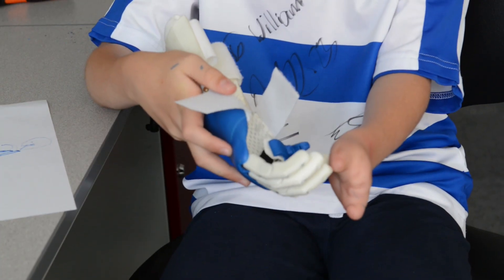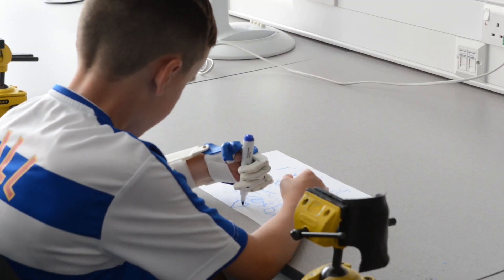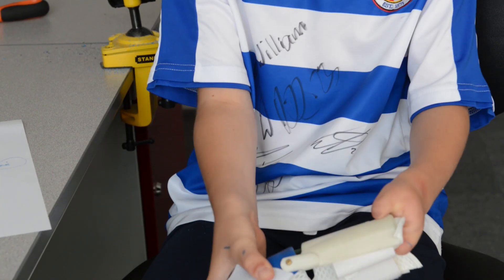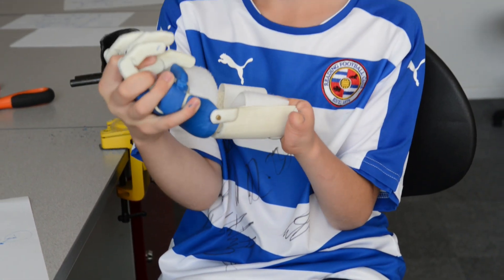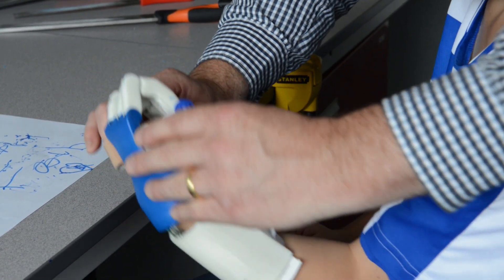As you can see, you've got those metal bits — they're on aeroplanes and they can bend up and down. And you've got the strings there, so when that bends like that, see the strings in there, when it bends, your fingers will come down a bit, like that. And I've got some movement in my thumb there.